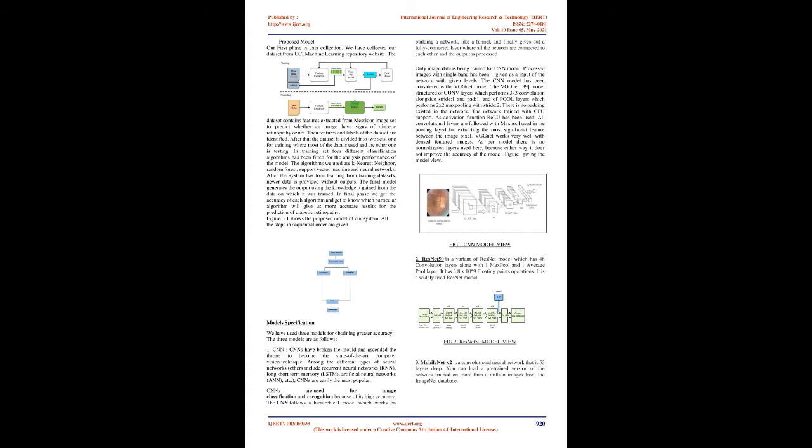Roychowdhury et al., in their paper, contributed to the reduction of the number of features to be used for lesion classification by feature ranking using AdaBoost. They proposed a novel 2-step hierarchical classification approach where non-lesions or false positives are discarded in the first step. In the second step, bright lesions are further classified as hard exudates along with cotton wool spots. Also, red lesions are classified as hemorrhages and microaneurysms, MA.